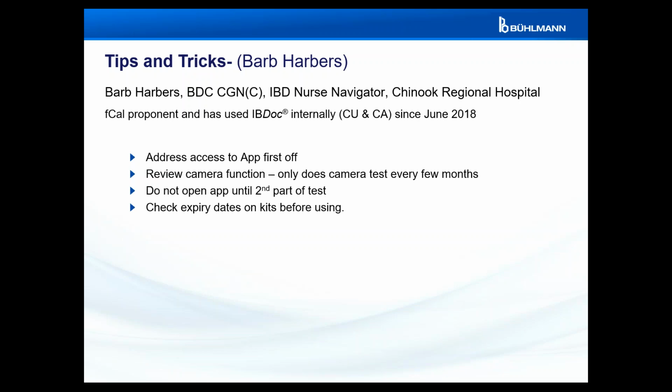The second thing we ran into was the camera function. And so I make it very clear to my patients that the app does all the work for them. It will open the camera when it needs to use the camera, so that they don't have to worry about that. Because some of my older patients, and I have patients up to the age of 82 using this app, some of them are definitely more phone friendly than others. And so for some of them, they didn't know, when do I have to open the camera, or how do I use the camera? And I'm like, you don't have to. The app will do all that for you.